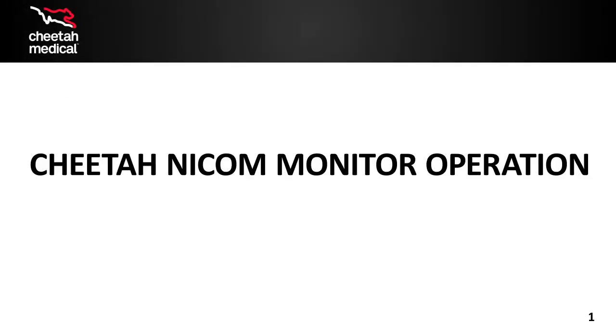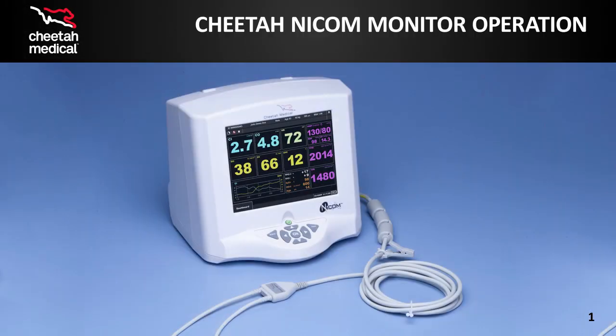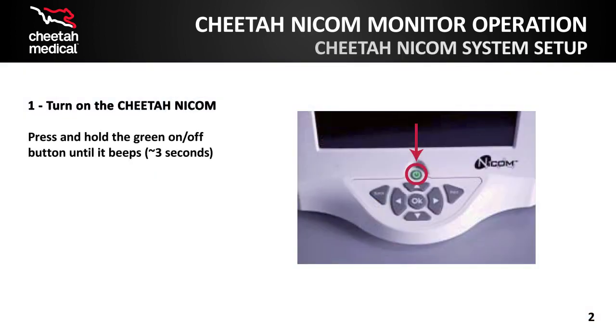Now let's cover the steps involved with the operation of the CHEETAH NICOM monitor. To turn on the monitor, press and hold the green power button located in the lower central area of the CHEETAH NICOM monitor until it beeps.